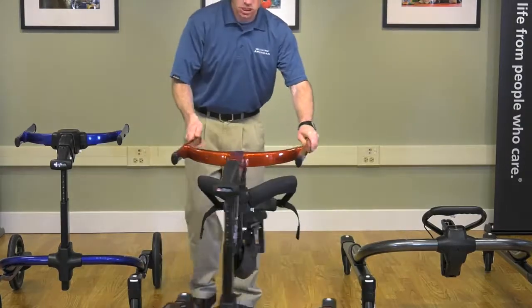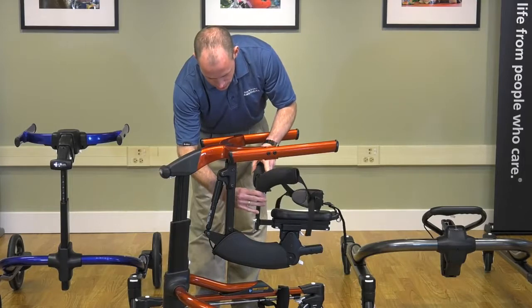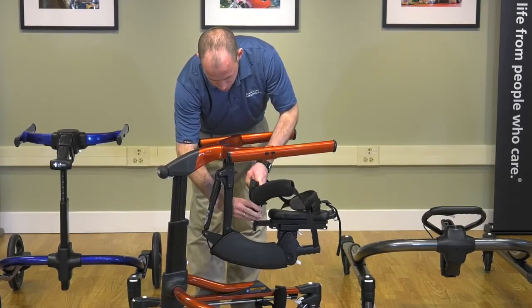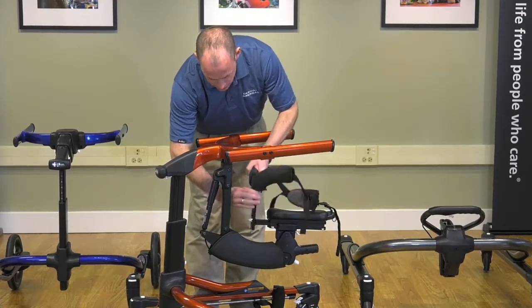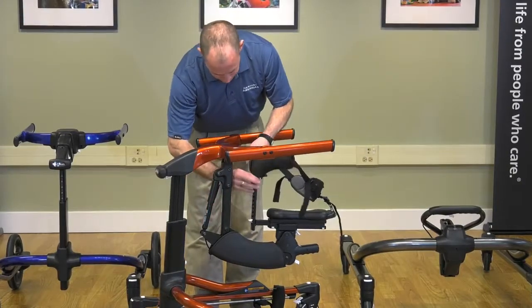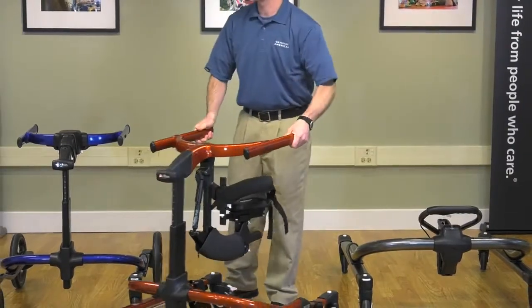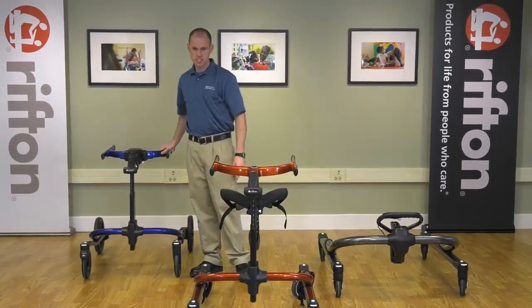The other adjustment you can make is the height of the hip corral by pushing this button. You can go all the way up and all the way down here with several different intervals in between. You can also take the hip corral all the way off if you need to, like that. So that covers all the basic positions that you can acquire with the multi-position saddle.